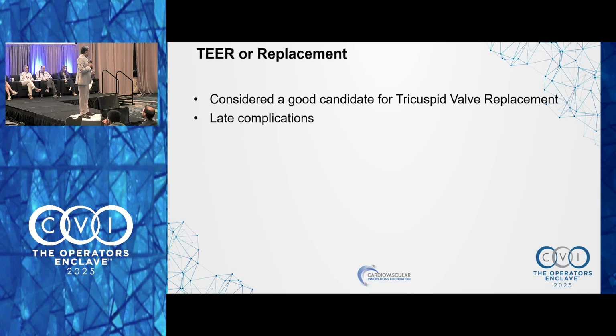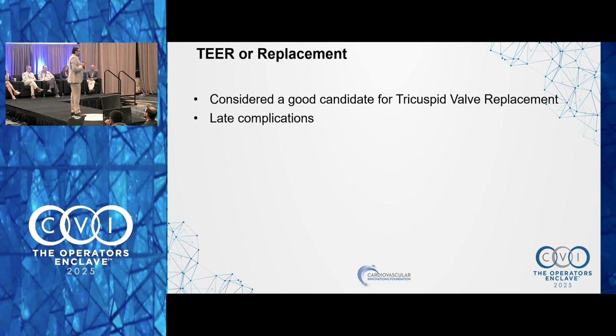So before I talk about this, I'll ask the audience what you would do. Lucy, what do you think of those images? You don't have to talk about my imaging. So I had done 2 TTVRs before this. Both had late complications, which we know is a signal in that group of patients. One was a late heart block about 3 weeks later from a pacer lead, and the other was a late pericardial effusion that came in tamponade. So with that PTSD in mind, you can tell which way I wanted to go. So we're not going to ask Manny.